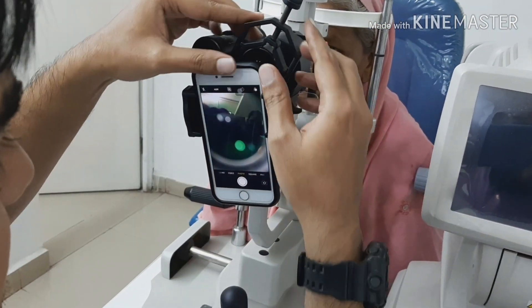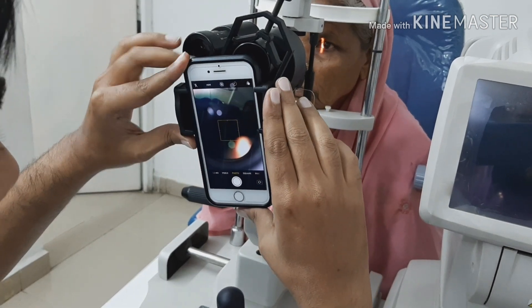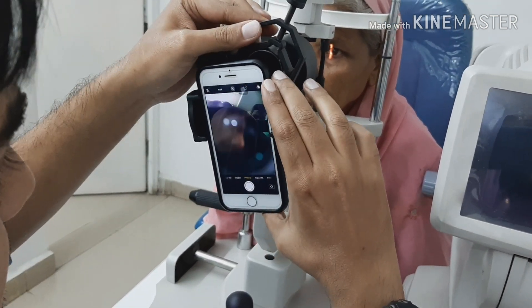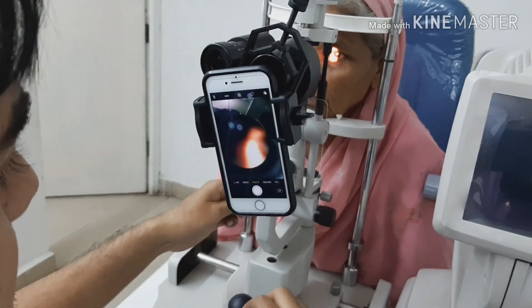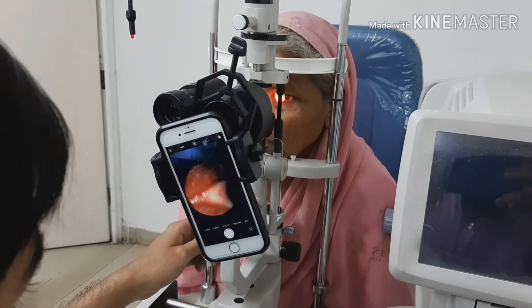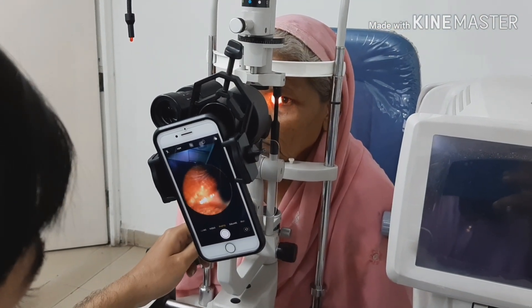Once you've done that, make a small slit and aim it toward the medial canthus so that the light does not irritate the patient. Then slowly position your smartphone and try to adjust the camera to the eyepiece so that you get a well-defined, full image of the eye.